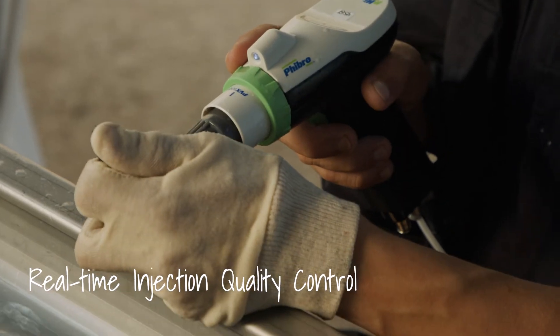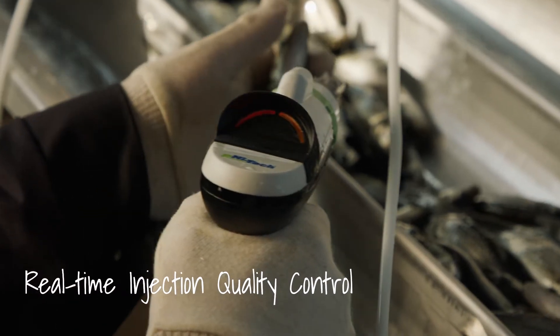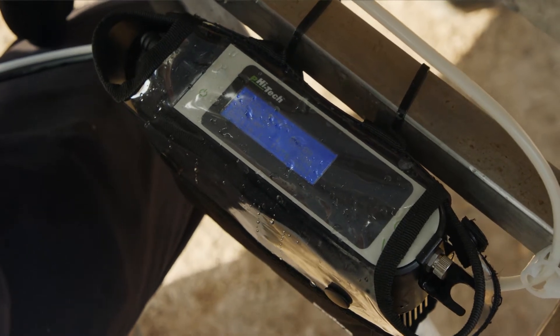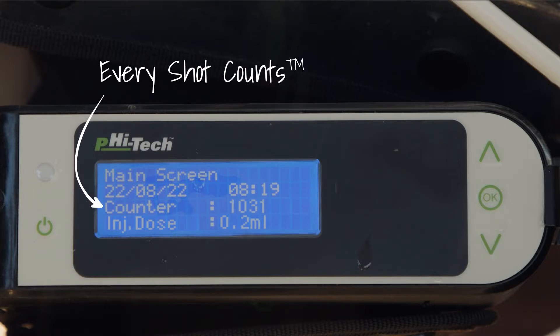Operators receive real-time alerts and injection quality feedback. Missed one. The control unit helps ensure accurate dosage so that every shot counts.